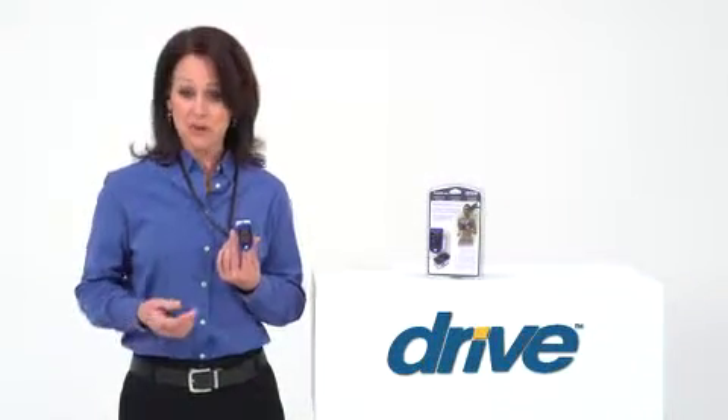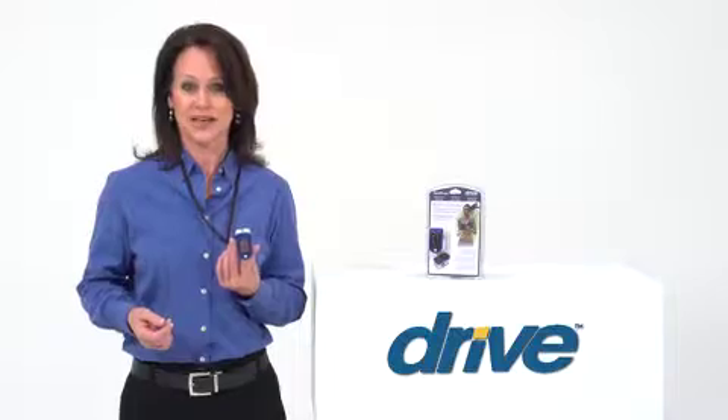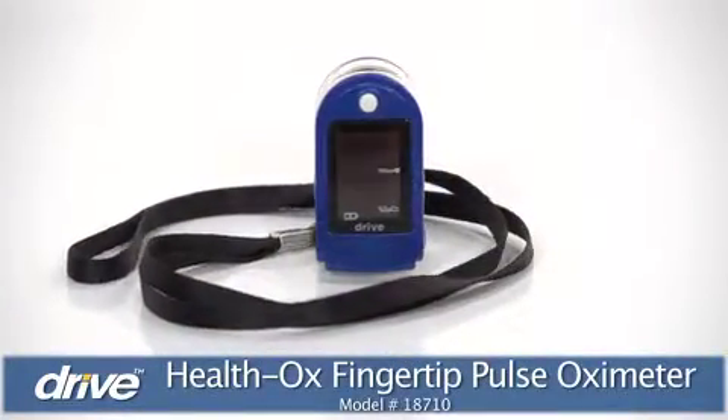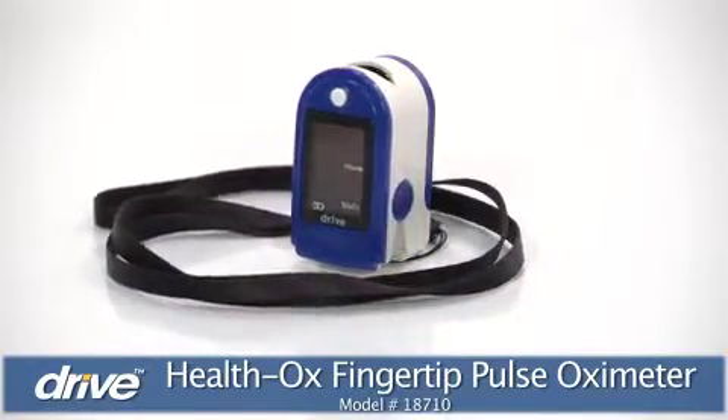Active people can benefit from knowing their pulse rate and oxygen saturation. This is especially true when they are exercising and trying to have the most effective and efficient workout. To give users an easy, convenient way to monitor these levels, Drive Medical offers their Health Ox Fingertip Pulse Oximeter.